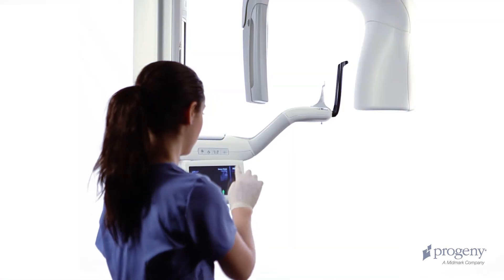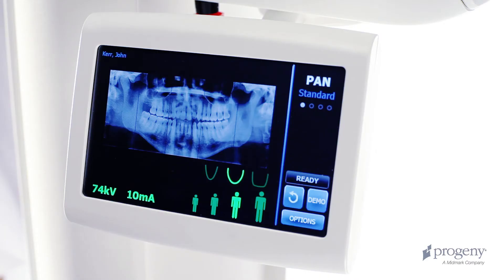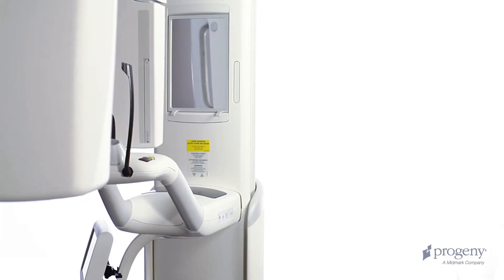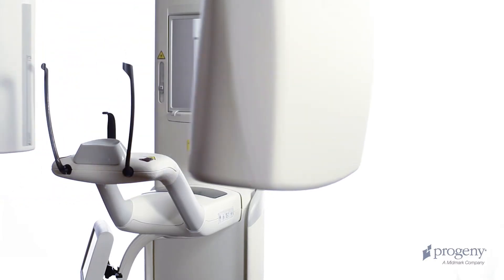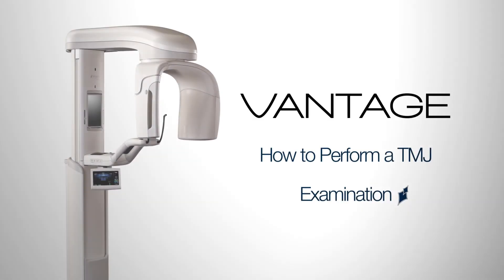At the end of an examination, the overhead structure is in the patient exit position. The gray ready indicator verifies this. Press the cycle button on the Vantage Touch once to bring the overhead structure to the patient entry position. How to perform the TMJ examination.